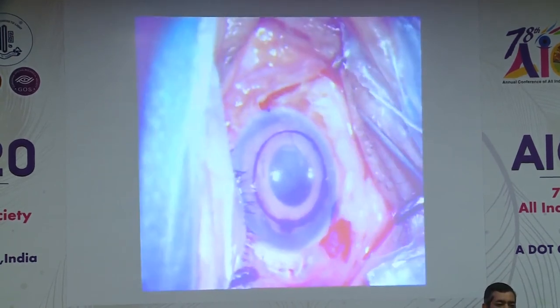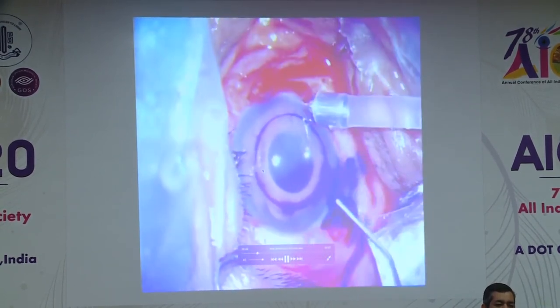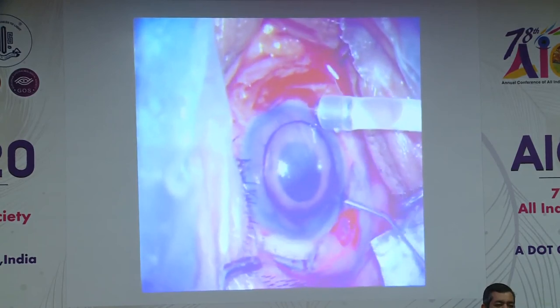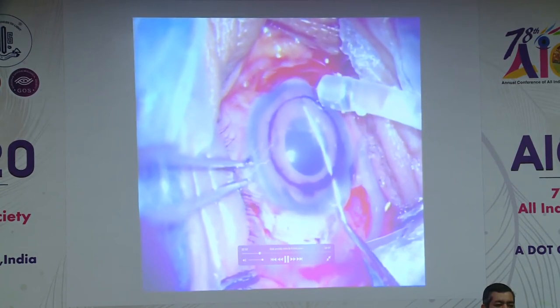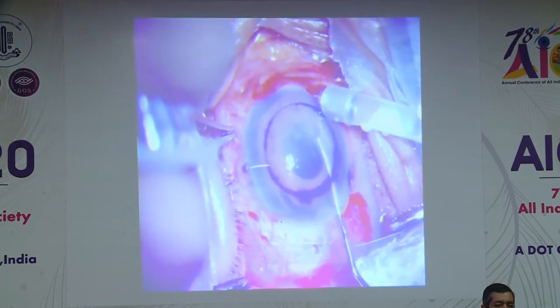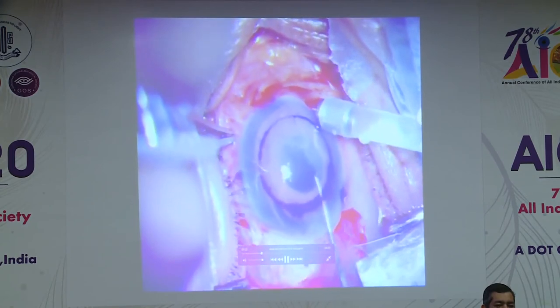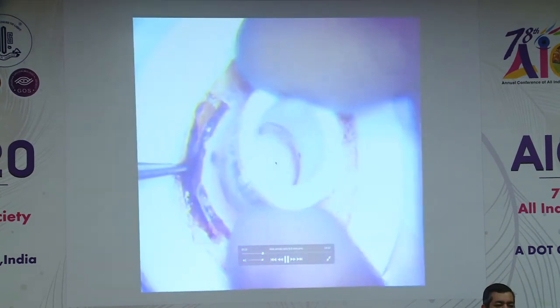I use a 25 gauge infusion. Here I had a problem which I didn't realize until after I started the surgery: there were sutures present from the IOL which was fixated. So I had to change my site from the traditional 9 o'clock. I had to go supratemporal, and after that I stained so as to mark the endothelium.